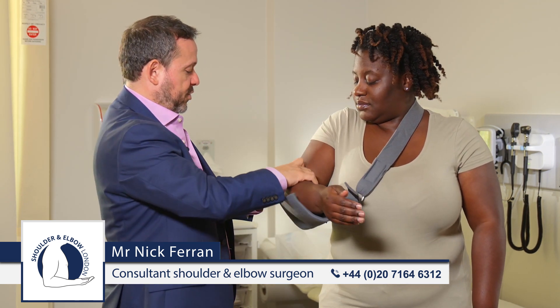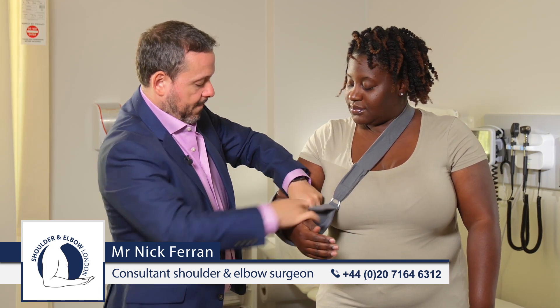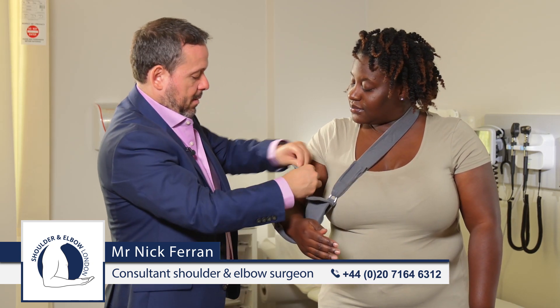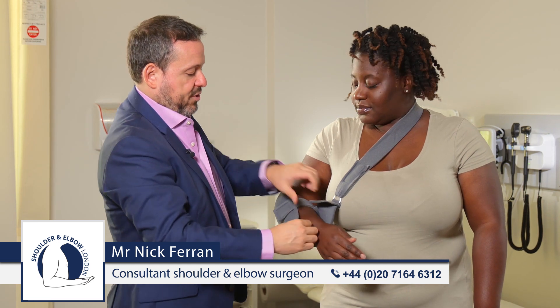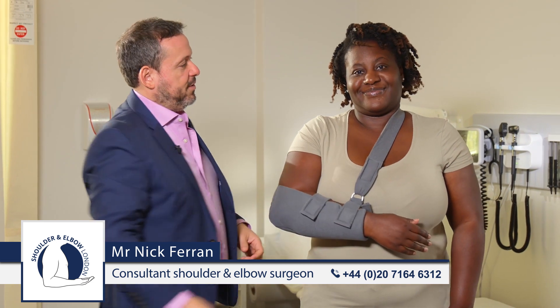To put the shoulder back in, get the sling back on, reattach the velcro straps, and you're ready to go.